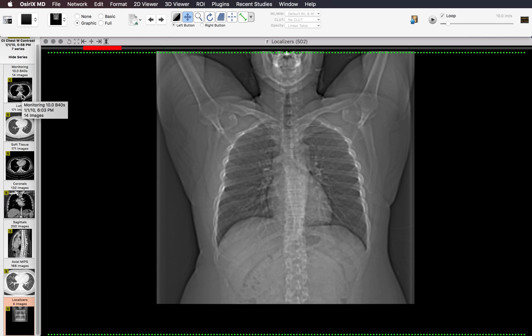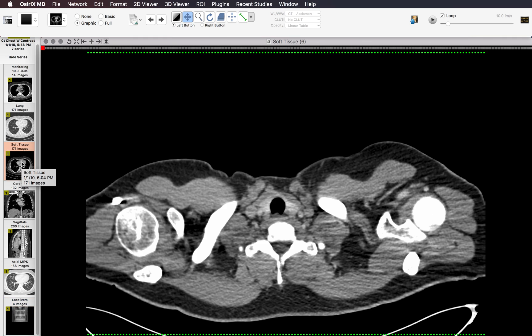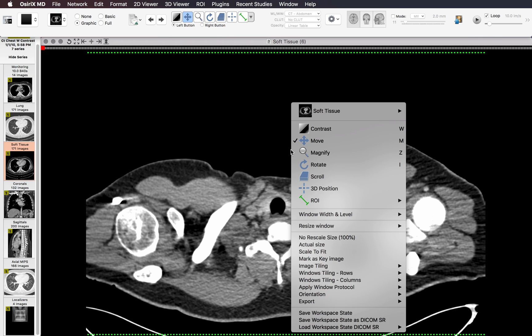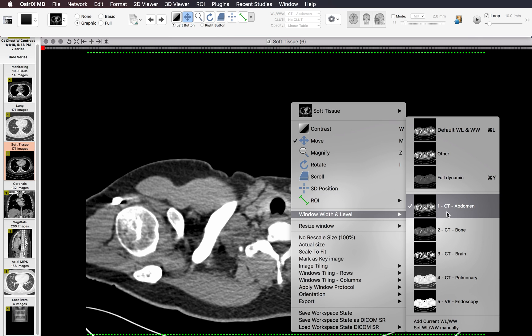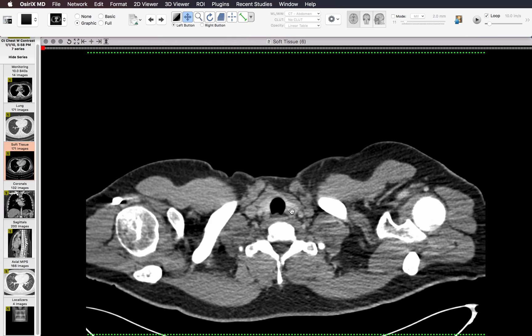The next thing I do is go to the soft tissues. I'll pull up the soft tissues and start with the supraclavicular region, making sure that I'm on the right window and level. I'm using the abdomen windows here because I want to accentuate the difference between the fat and the soft tissues. The first thing I look at is the thyroid gland, making sure that it's not enlarged and that it doesn't have any nodules in it.